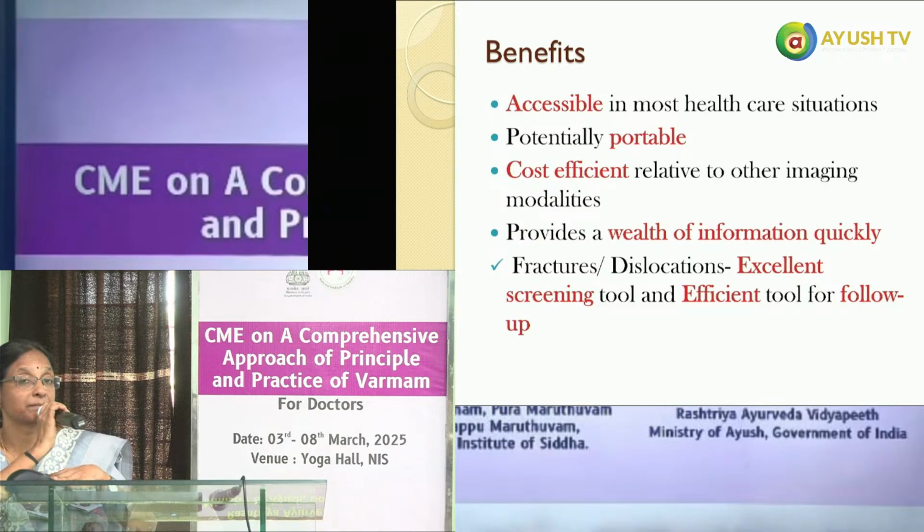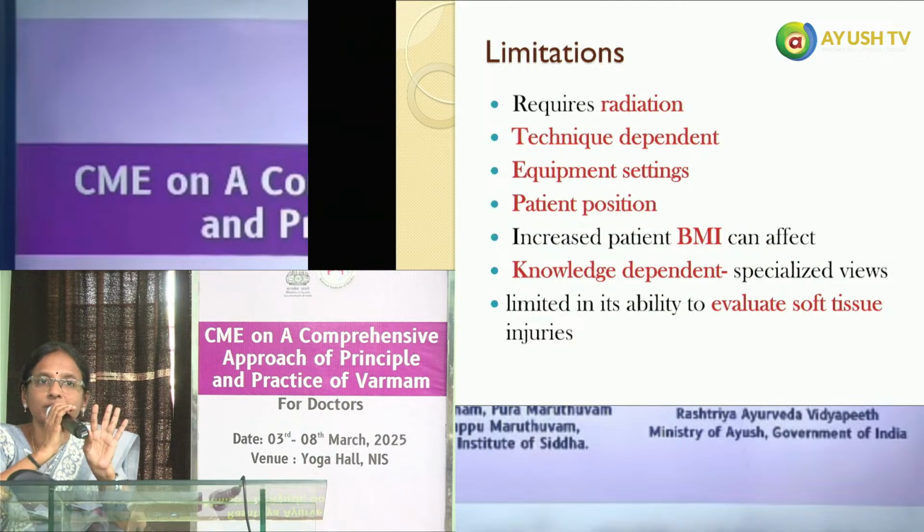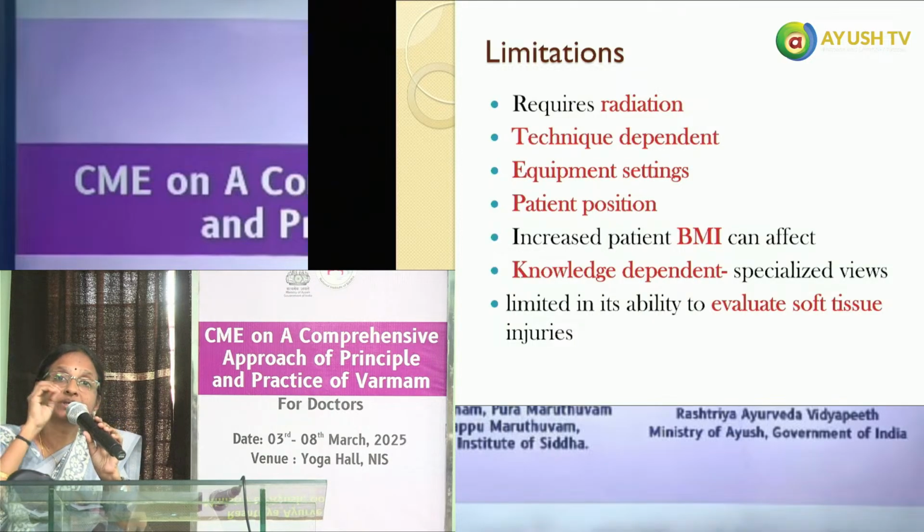Now we know the benefits of X-rays. So these will be the limitations. The important limitation is radiation. It is technique dependent, so it depends on the factors. In all X-rays, the procedure is determined by setting some factors.